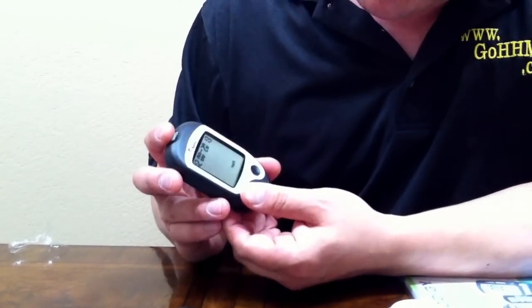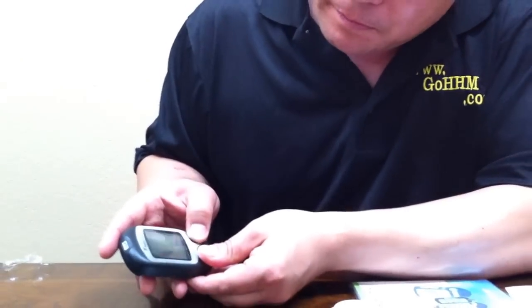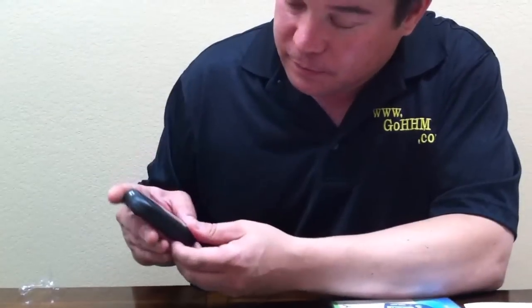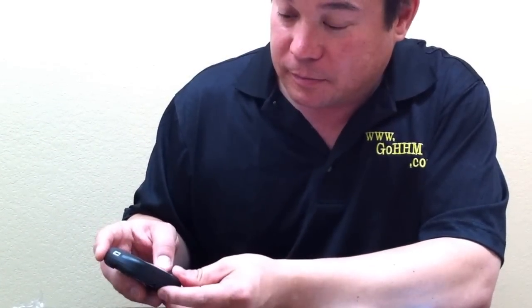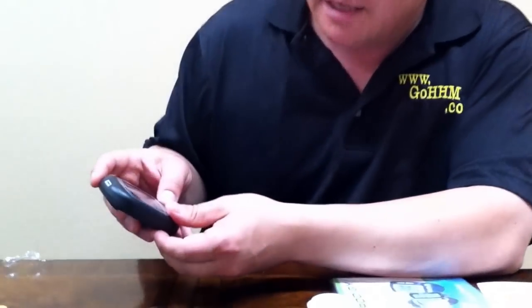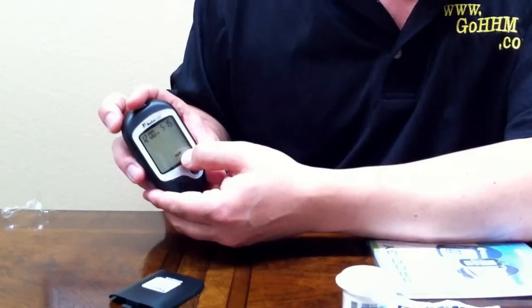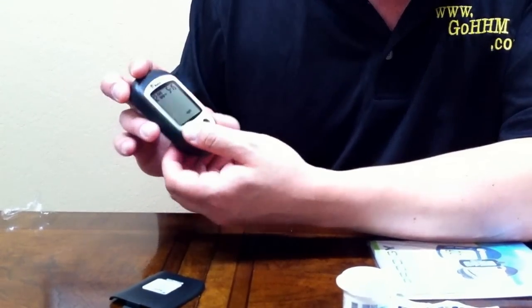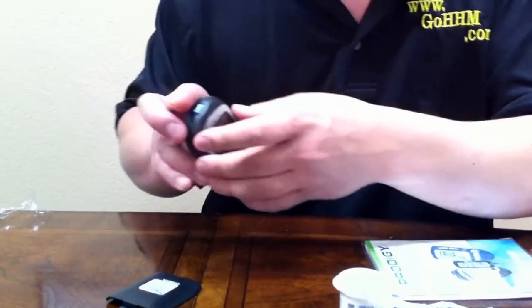Then we're going to set the date — it is 2-13 and the date is 5-15. Then we set the time and the minutes. Milligrams per deciliter is what is understood most places in America. And then we don't want to delete the memory, and it turns off.